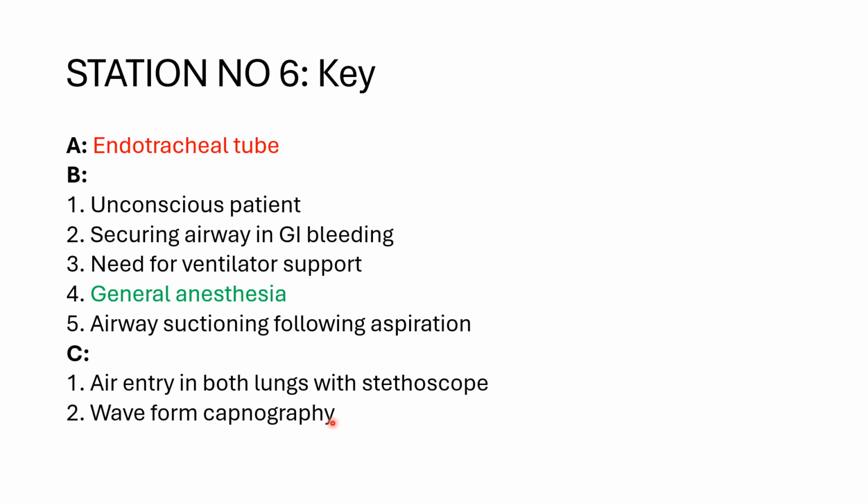So how do we confirm its position? Air entry in both lungs with stethoscope. You have to listen to it. Waveform capnography. This is another method to confirm its position.